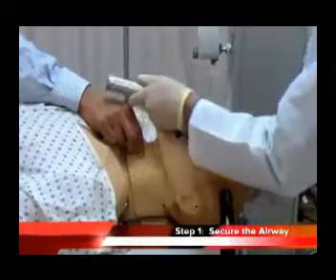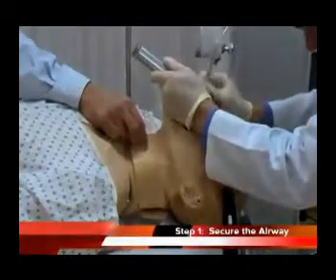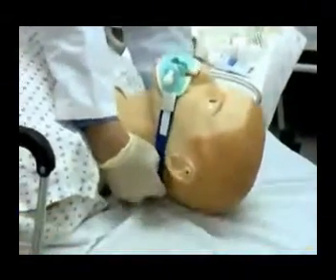Aspiration is the most common complication of gastric lavage, so don't use it for sedated patients or patients who have lost their airway reflexes unless you intubate them first. Step 2. If desired, place an ET tube stabilizing device to keep the mouth of a non-compliant patient open.